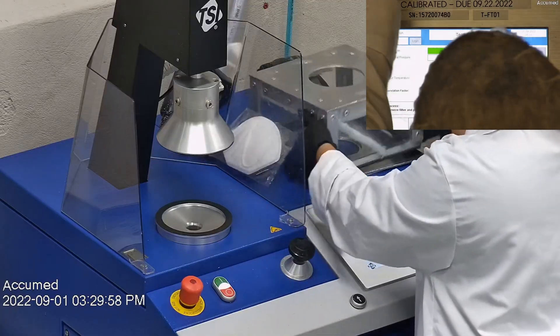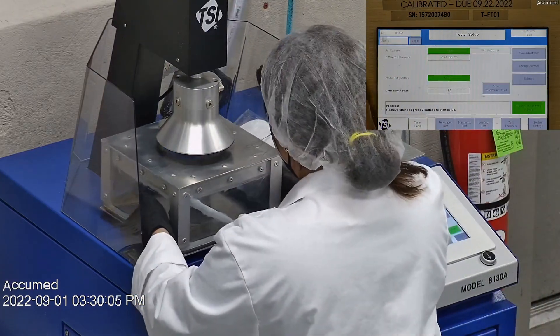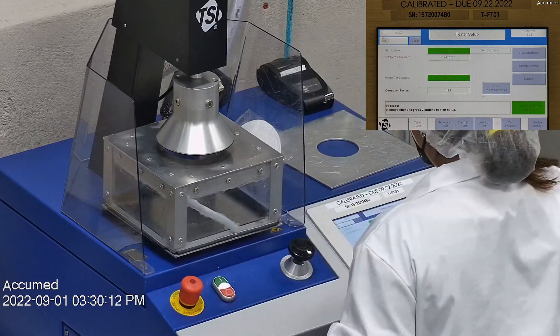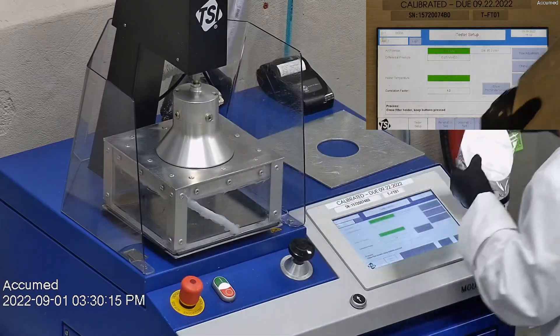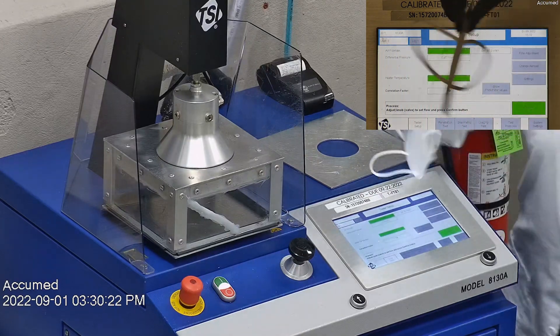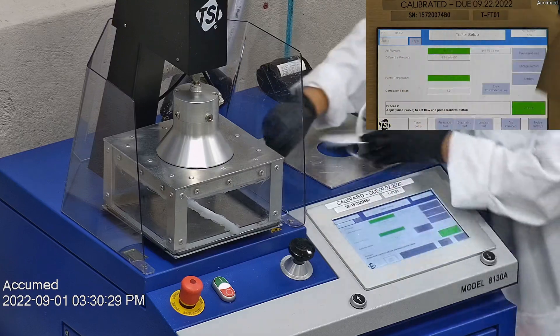Let's go ahead and see how these test on our TSI machine. We're going to be testing both the filtration efficiency and pressure drop. This is our TSI machine model 8130A, which is also the same filtration testing machine that NIOSH uses to approve N95 respirators. Our procedure is also inspired by NIOSH. We first run a tester setup and start removing the headband from the respirator before placing it onto the testing plate to ensure a proper seal.